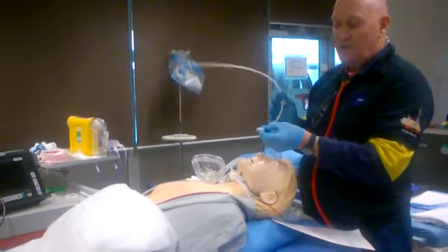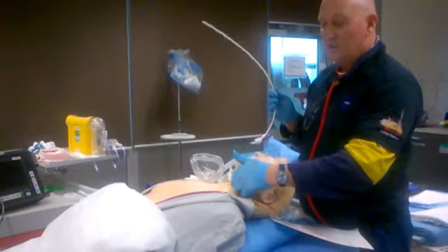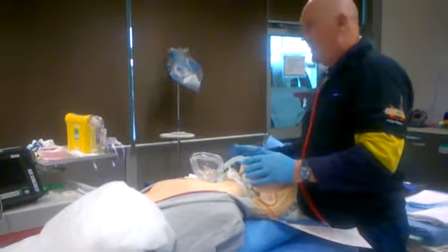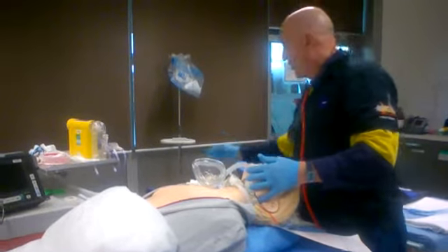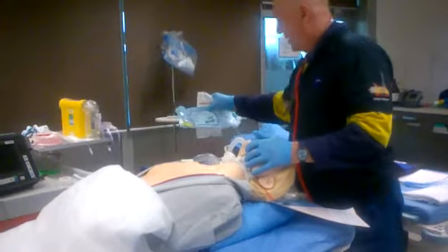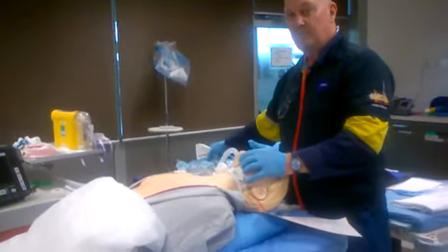Sometimes you put a kink on the end of the bougie, and that hits along the inside of the carina. Failing that, we make a phone call. We also have a cric kit prepared in case we have to do that.